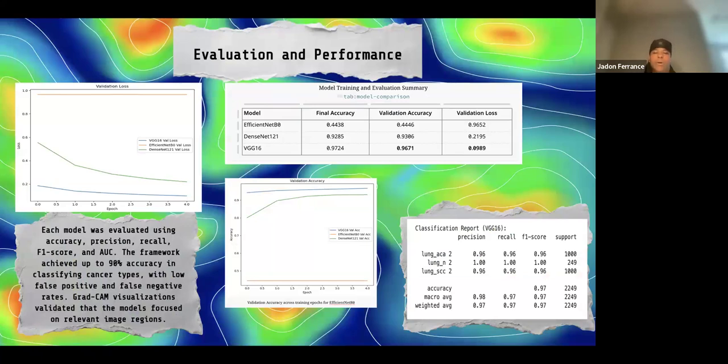We evaluated each model using accuracy, precision, recall, F1 score, and AUC. The framework achieved up to a 90% accuracy with low false positives and negatives. GradCam confirmed that models focused on the correct image regions, validating the framework's clinical reliability.